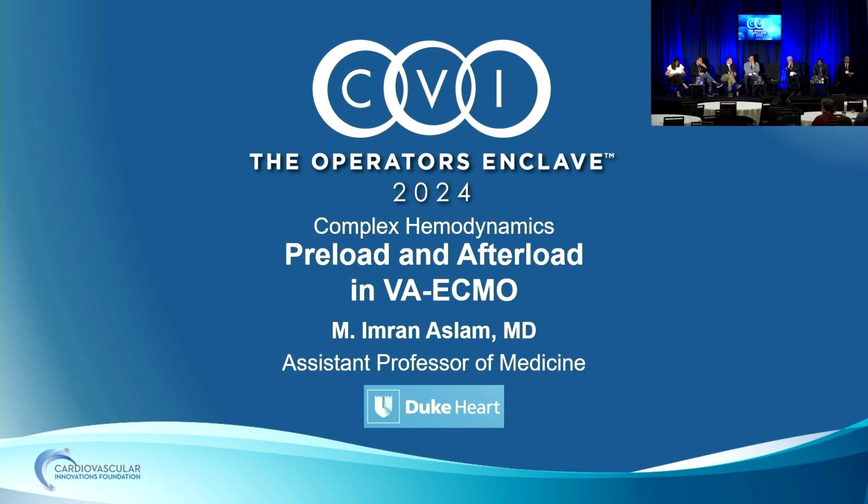Of course, people say, why don't I try first before I do that? And I don't know what other people's thoughts are about other devices, like TandemHeart. Would that be another approach to unload at the same time? Of course, it needs an extra skill to do the transseptal puncture and everything, so it's not available to everybody. But we have very good experience in my institution with the TandemHeart so far.